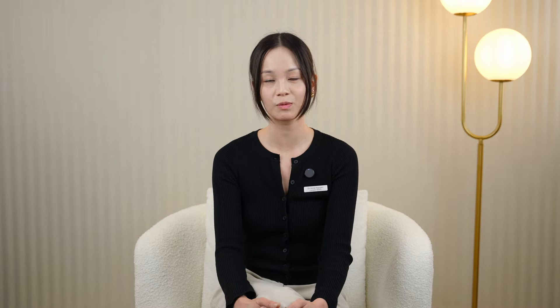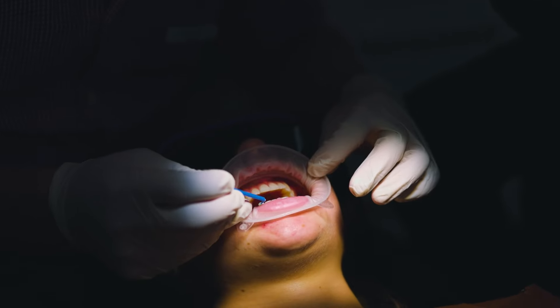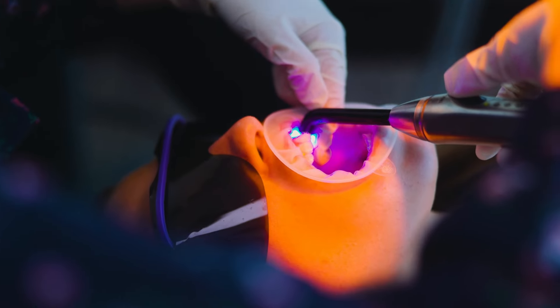Additionally, often with Invisalign, some interproximal reduction may be required. Interproximal reduction is the creation of space in between the teeth, and this is to allow alignment to occur. In some clinical cases, sometimes tooth removal is necessary to create space for alignment to occur. This can also be designed through the Invisalign software.